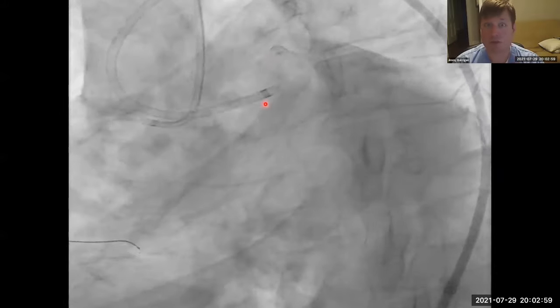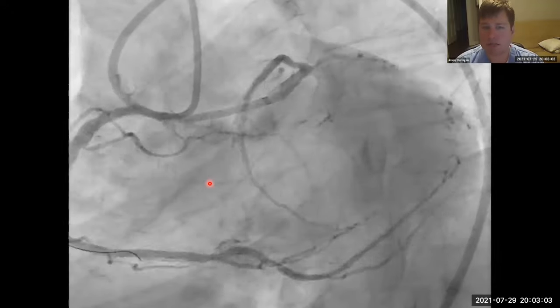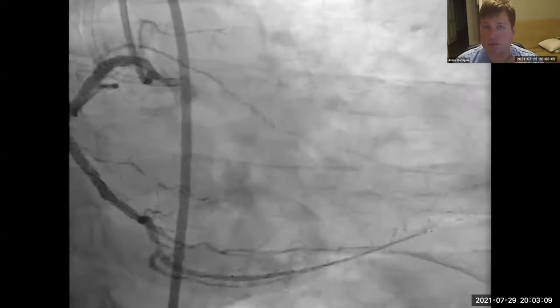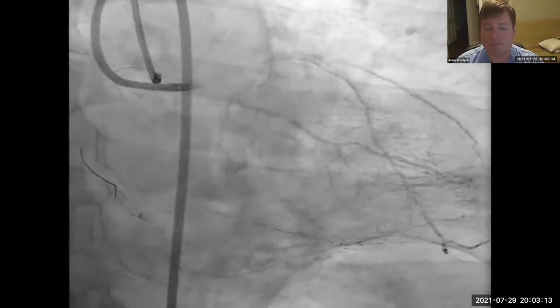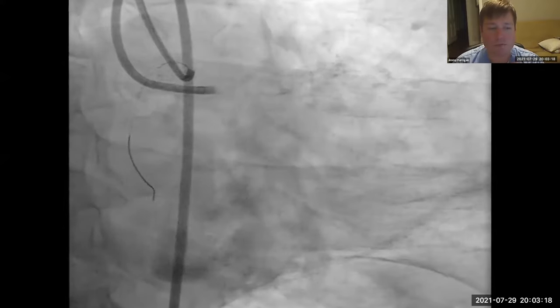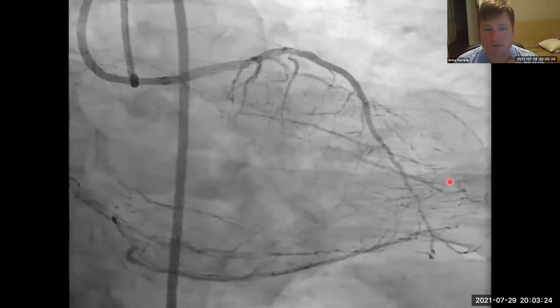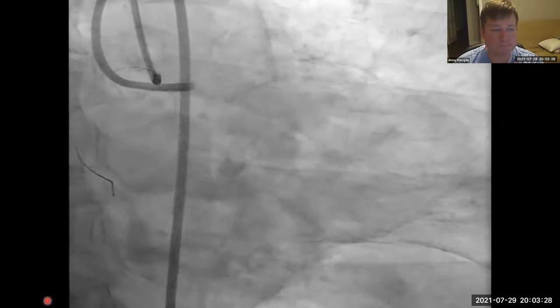When we're performing angiograms, a luminogram really, we're looking for the contrast dye to be dark, to be uniform, the walls of the vessel to be smooth. And as I said, we take these pictures in multiple different angles so that we don't miss something that might be significant. And in this view, you can really appreciate the diagonal branch and the circumflex branch filling retrograde via collaterals from the right and antegrade from the left. So this is the circumflex that fills in, the diagonals over here, left main LAD.